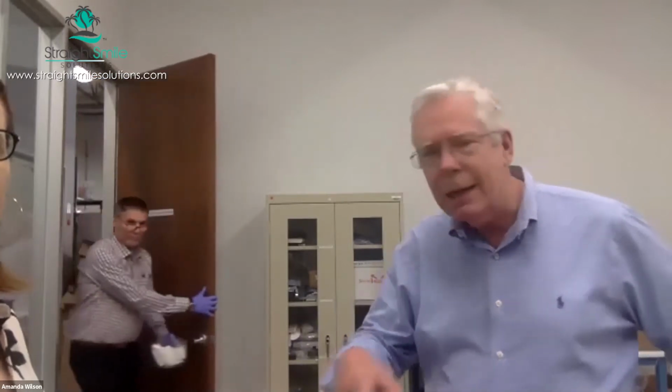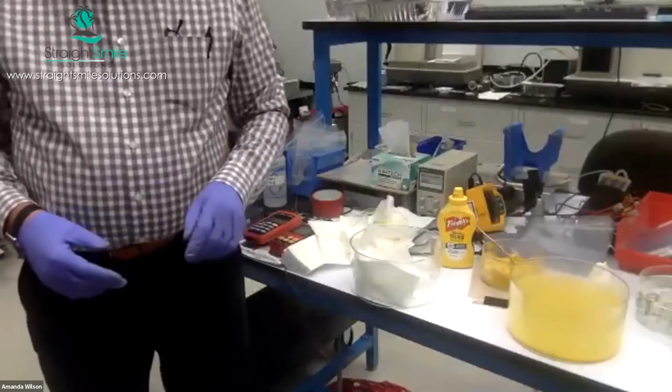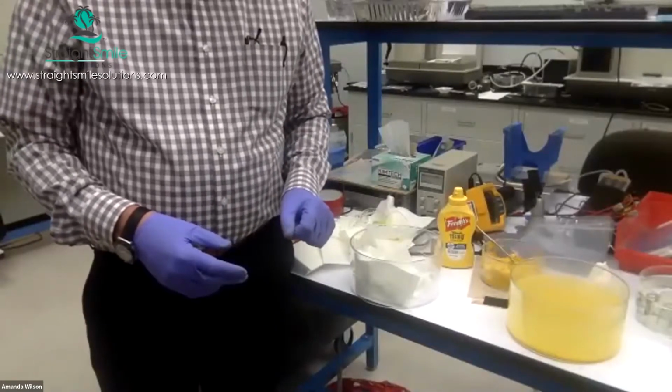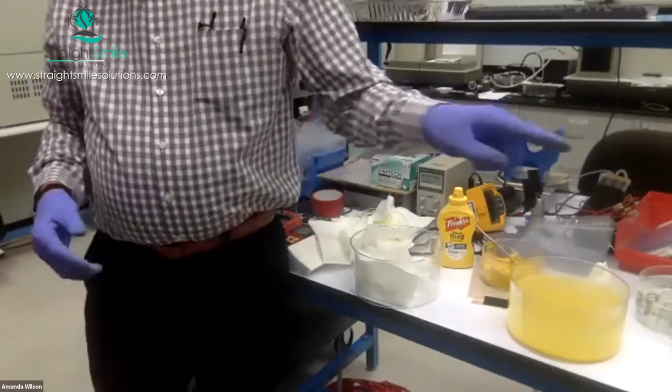When we're cutting and trimming or polishing a Flex aligner, we use a curved pair of scissors, a small pair of high quality scissors to do the initial cut and also to do the final cut as well. Some labs like to use a heat knife to do the initial cut, and then for the final cut, they'll go back and use a pair of high quality curved scissors. But that's something to seriously consider when you're selecting your thermoforming product, because patients do eat with them, and they just do.